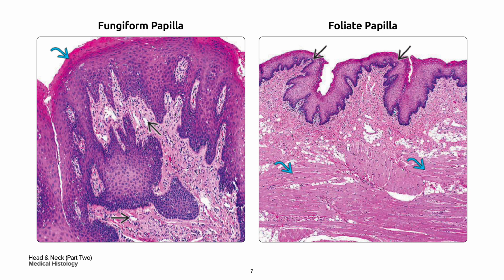On your left is a fungiform papilla that has a thin epithelial surface with limited parakeratinization in curved blue arrow, and the underlying stroma rich in small blood vessels in black single arrow, making them look red or pink grossly. Your connective tissue stroma has small nerves that innervate the rare taste buds that are found in some fungiform papilla. On your right, unlike in some mammals, the foliate papilla in single black arrow are rudimentary in humans. Note also that a small amount of loose connective tissue is separating the mucosa from your striated muscle in curved blue arrow.